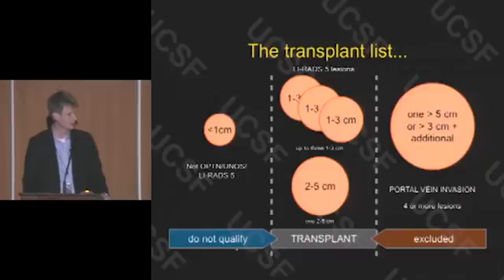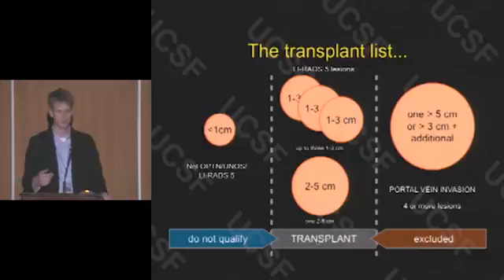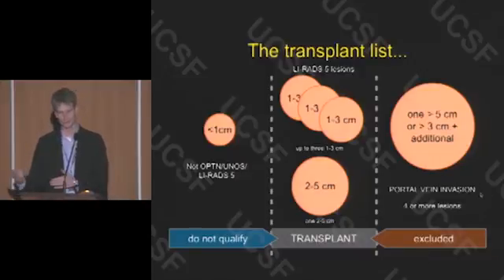And the thing I want to point out is one of the keys here is to get your patients into the transplant criteria. You don't want to say there's 20 things that are maybe HCC, that's multifocal HCC, and then they can't be transplanted. You instead want to say, hey, there's one of these that has all the criteria to be LIRADS 5, that's HCC, then there's a bunch of LIRADS 3 lesions, right? Because then the patient can go to the board to get reviewed to see if they qualify for transplant. And in the same way, you don't want to overcall too many lesions to bring them out.